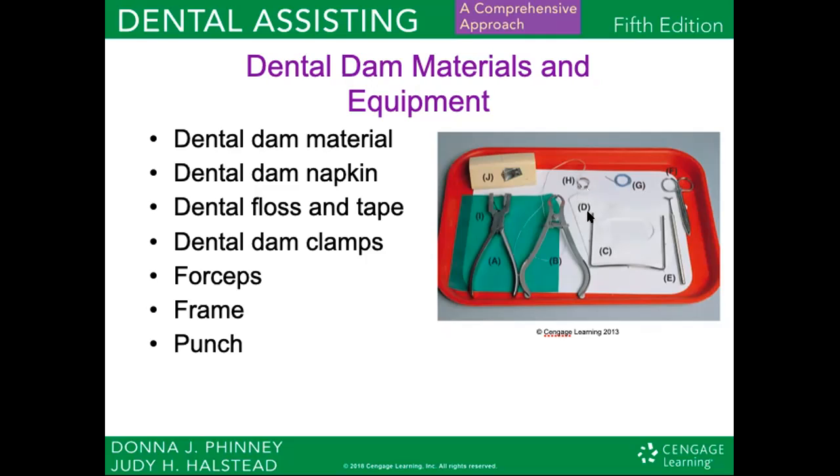The frame is what we see here, item C, and the dental dam frame or holder is designed to stretch and secure the dam in place across the patient's face. It's got these little prongs or barbs on either end, and what that does is it holds that latex piece on. So as you stretch it over the frame, you hold it onto the frame by those little prongs.